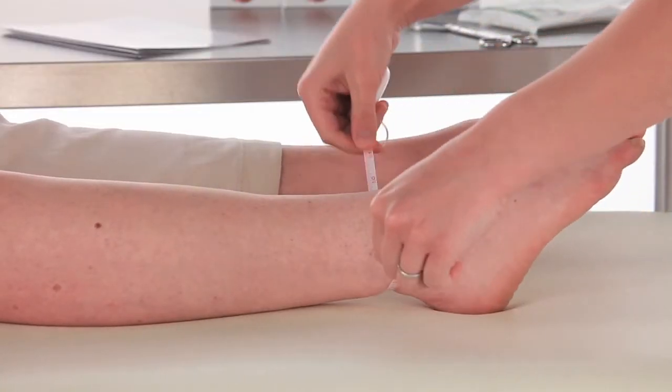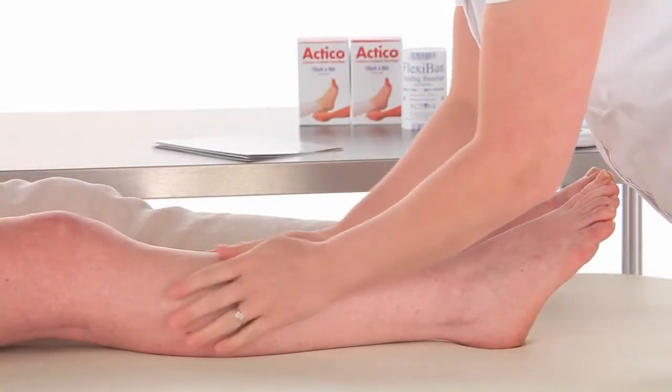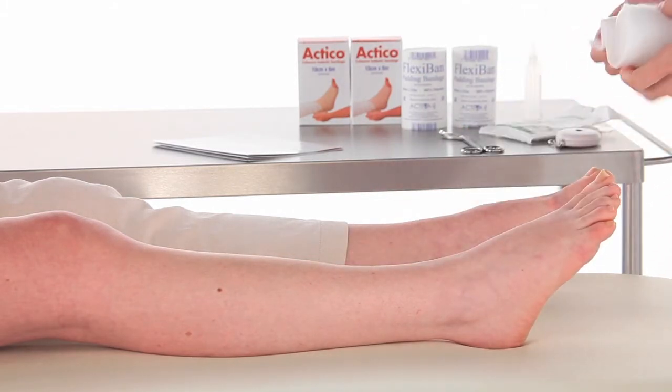Measure the ankle circumference before and after the padding layer is applied. Assess the shape of the limb, ensuring sufficient padding is used to protect vulnerable areas and, if necessary, reshape the leg to provide graduated compression.